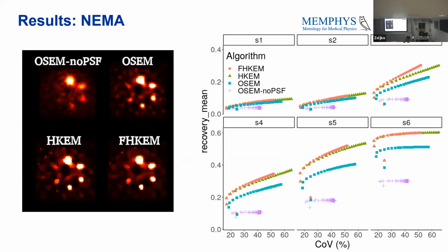From this result, it seems like the frozen version in red is sometimes providing higher uptake and less noise. You can also see it in the images, so I was kind of optimistic about that.